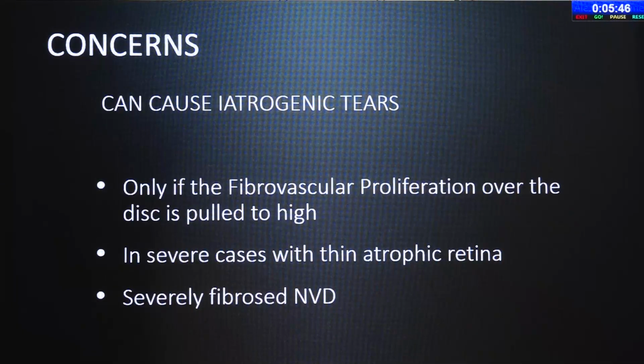Another concern is that it can cause iatrogenic tears, but only if you pull too high and too heavy, these tears may happen. In severe cases with thin atrophic retina, you have to take care. And once you start doing it, you will automatically come to know how much pull you have to apply to avoid these type of complications.